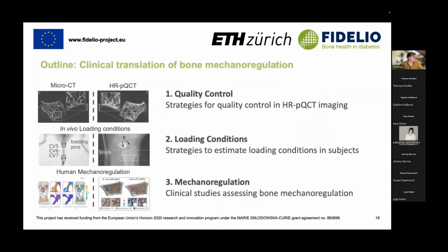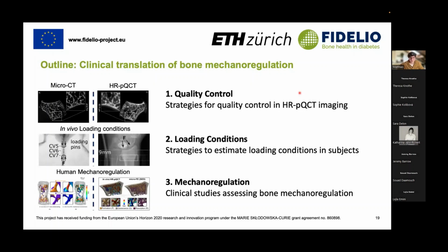And so, of course, it would be best if we could control better for motion or remove motion artifacts. But the current state is that this is really difficult. We've tried to enhance images afterwards as well, but it's really challenging still. And so the way to get consistent image quality is to control for only high quality scans to be included in your study, so there's at least no systematic bias within the data that you report.